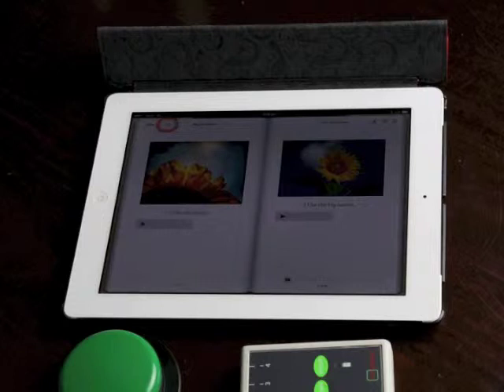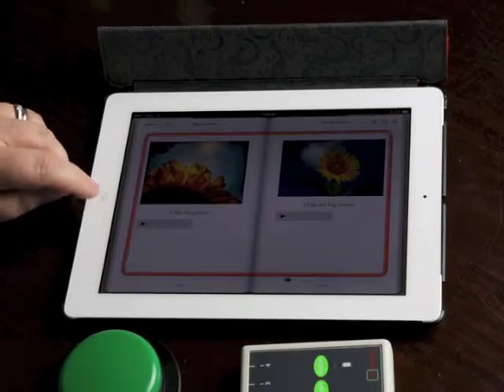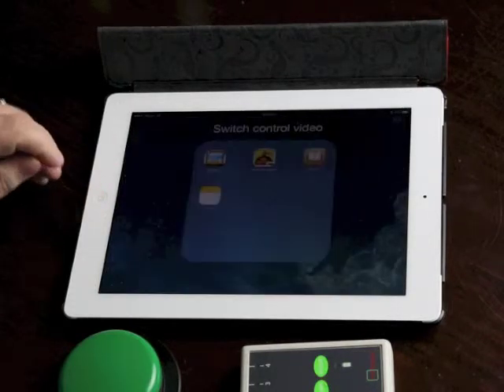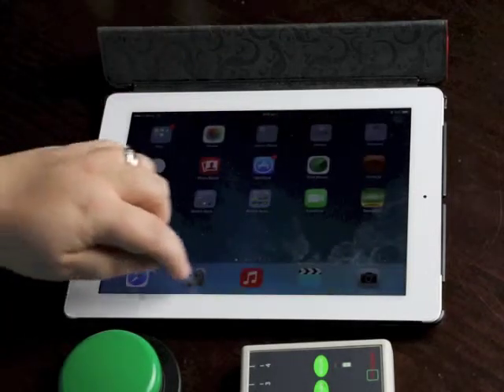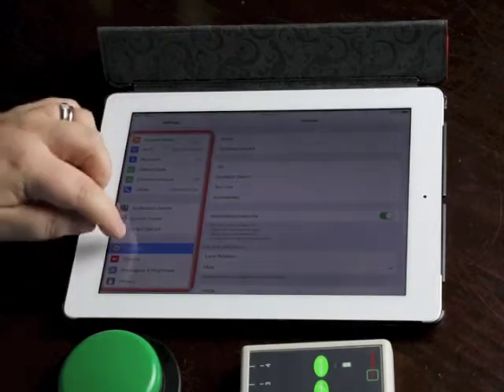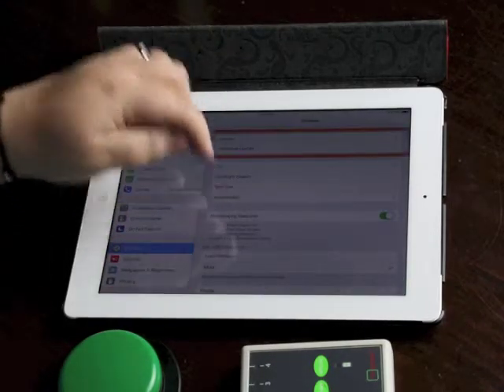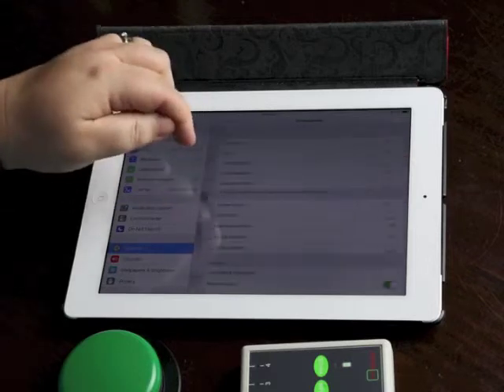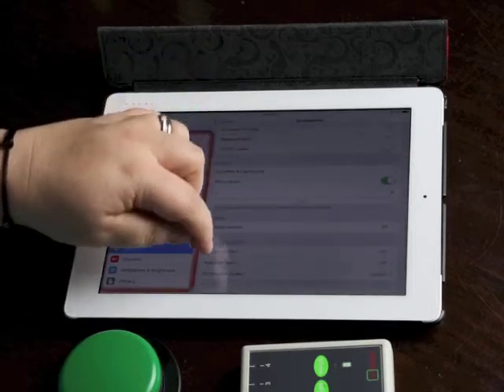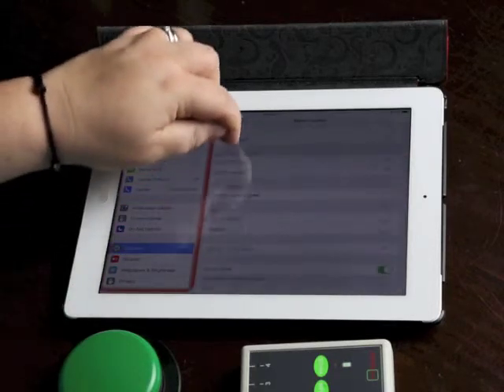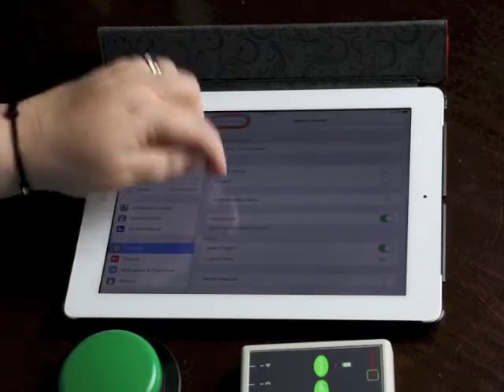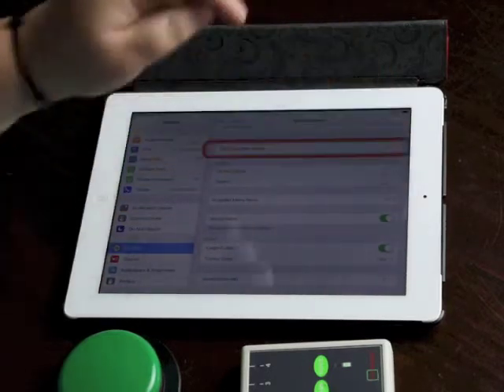So auditory scanning is the final thing I did want to talk to you about. I'm going to press the home button physically and go back to my settings, into general, into accessibility and into switch control. I'm going to come down here to speech and turn on auditory scanning.